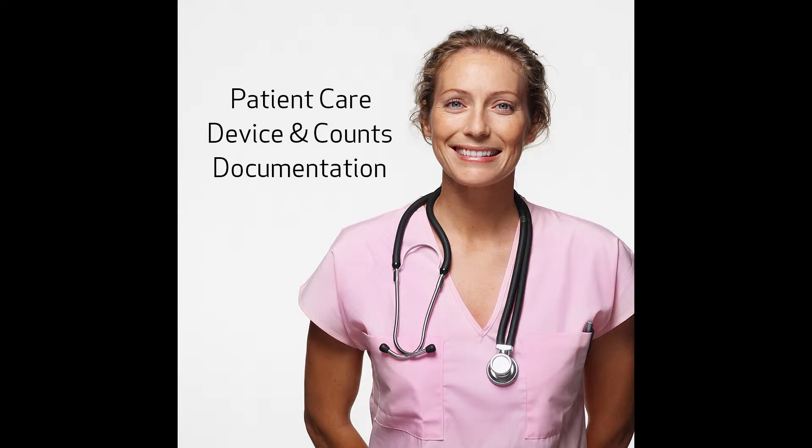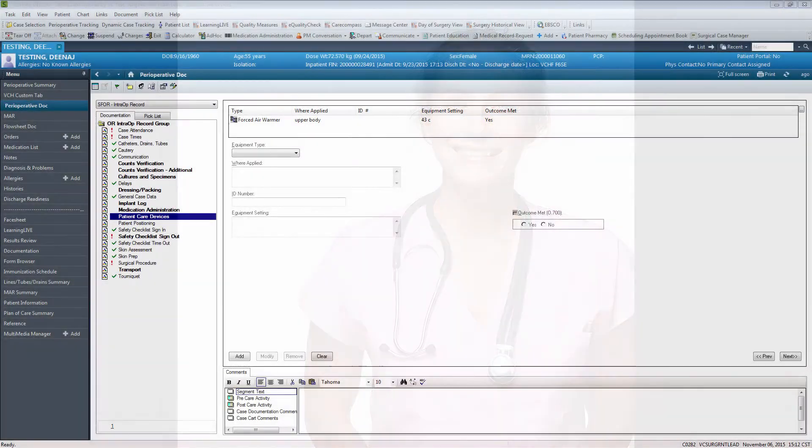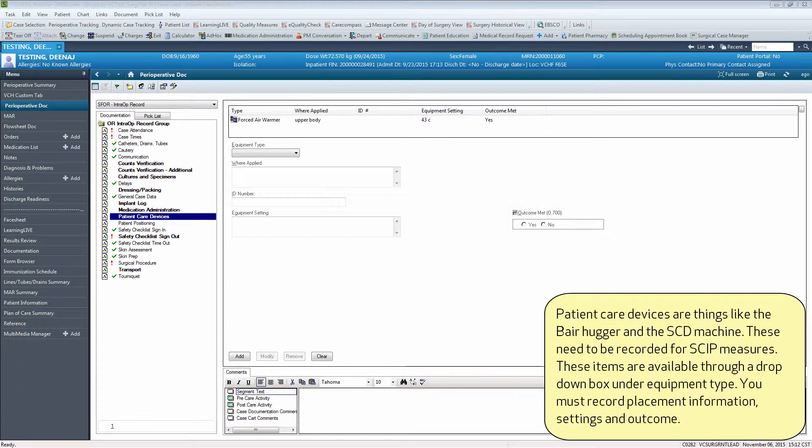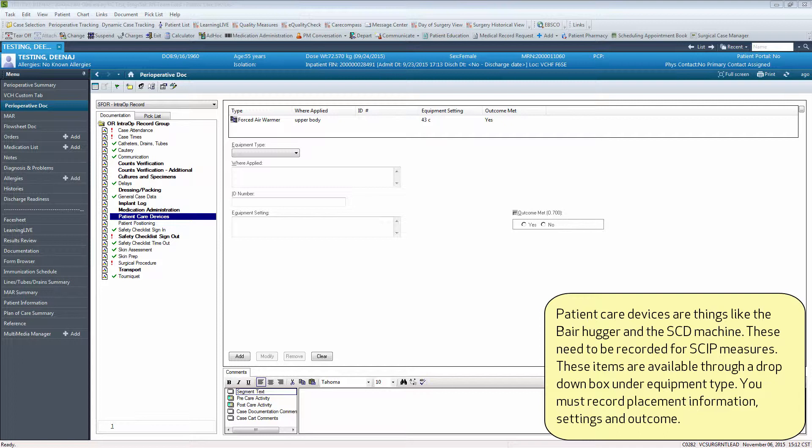This video will teach you about patient care device and counts documentation within the periop document. Patient care devices are things like the bear hugger and the SCD machine. These need to be recorded for SCIP measures.